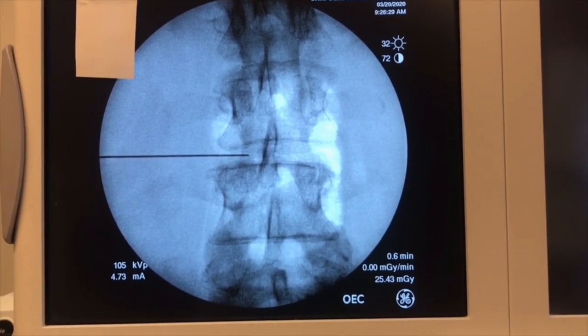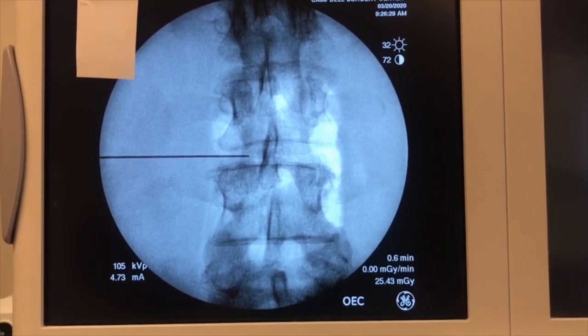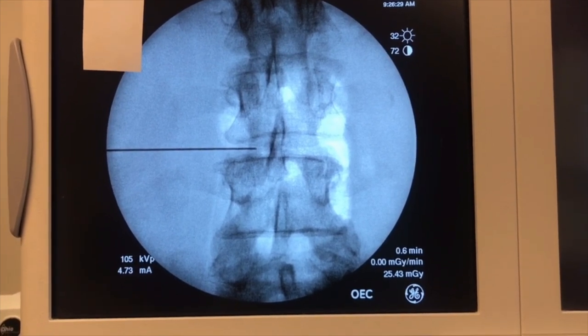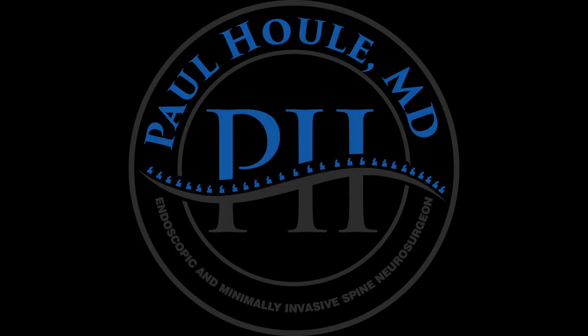If you have a contained posterolateral herniation, you may decide to go ahead and advance the needle into the annulus a little bit and anchor the guide wire in the annulus. That makes it a little more stable when you're doing your reaming and cannula placement.